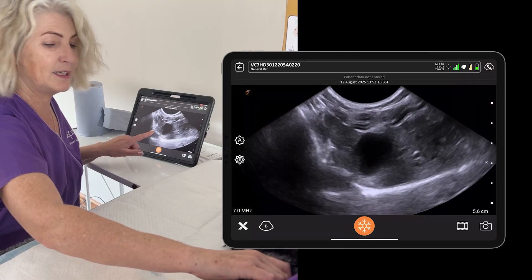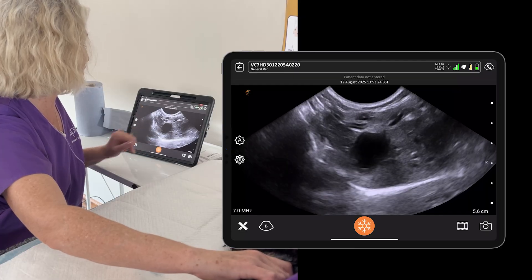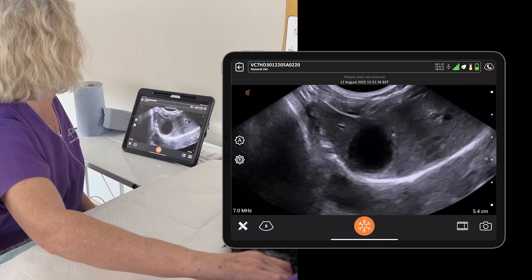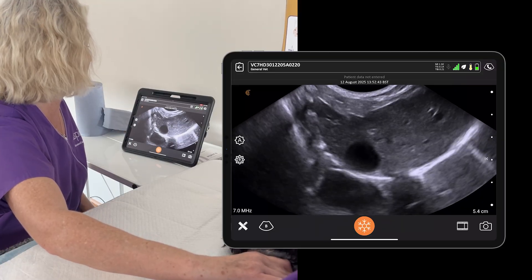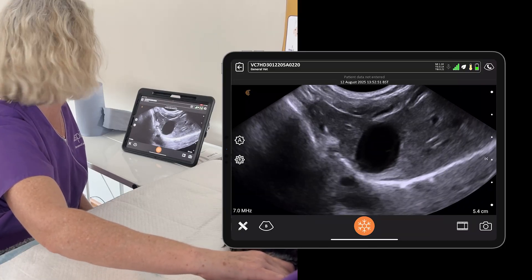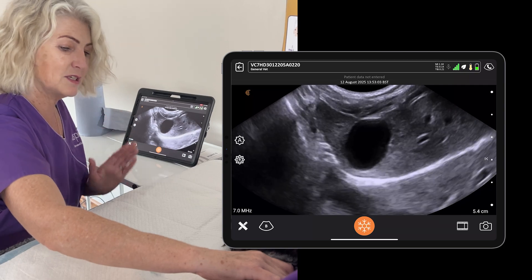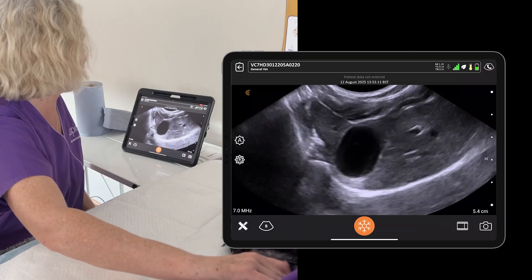Let's bring the gallbladder into the centre of the screen — ideally the region of interest should be in the middle of your screen. Keeping the probe in the short axis approach, I'm going to scan all the way through in one direction and then all the way back, looking around the gallbladder. We want to make sure there's no pericholecystic fluid, that the wall is nice and thin and regular, and that there's no obvious filling contents or defects that might worry us. It is quite common to find a little bit of layered sludge in dogs, so don't over-call that. She's got no sludge in there.